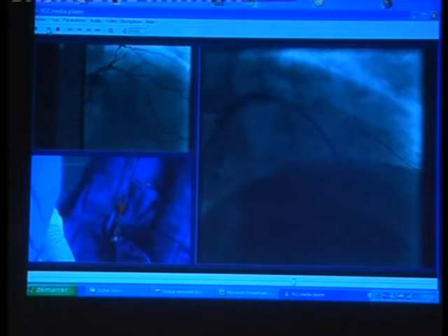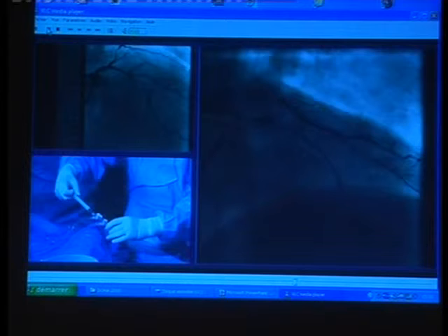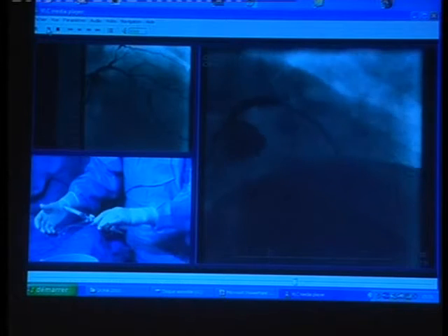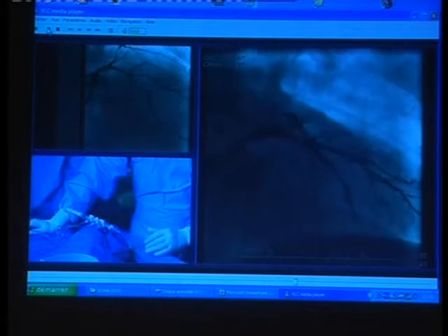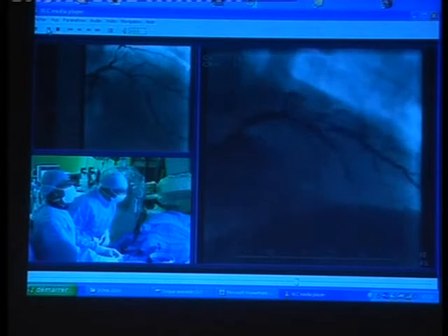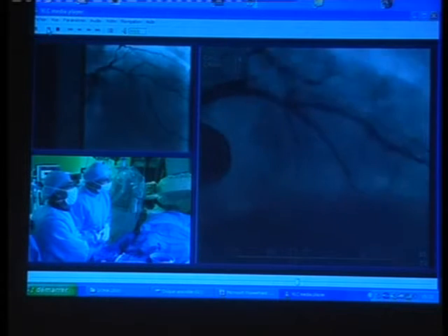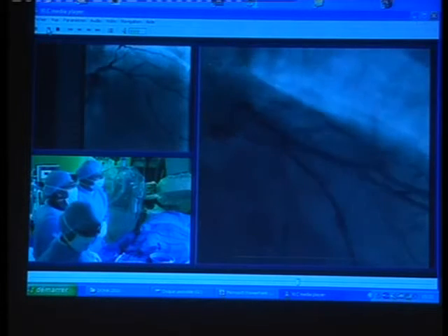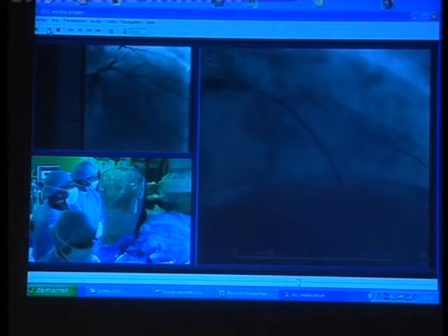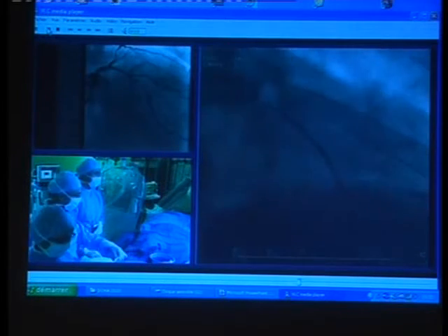Now it's certainly the most difficult part of the procedure: to precisely place the proximal marker of the balloon of the stent. You can zoom just below the origin, beyond the origin. It's not too bad, huh? Maybe we will reconsider on the other view. The stent begins just after the marker. It's not on the marker.